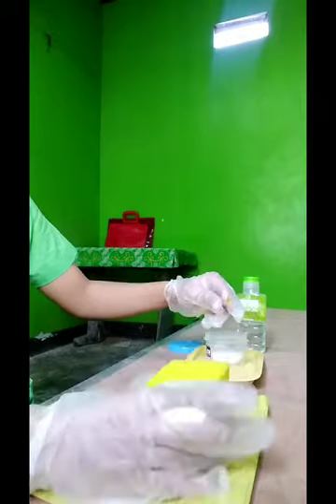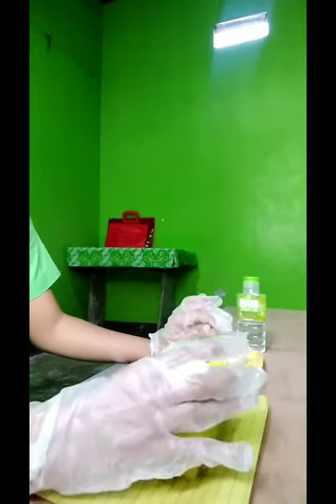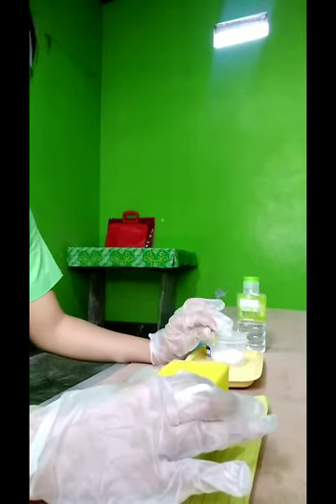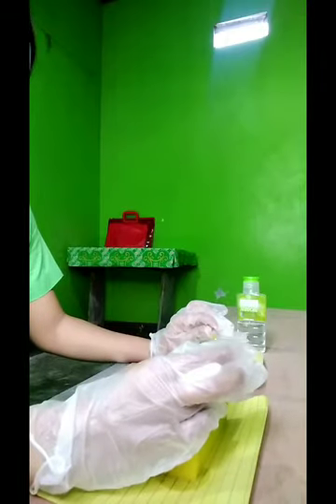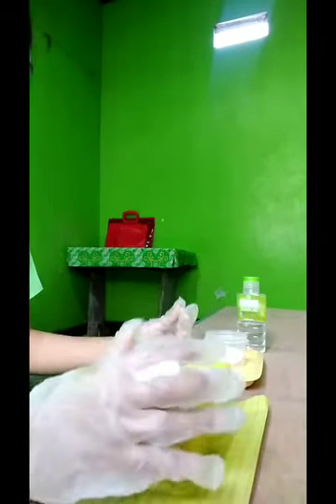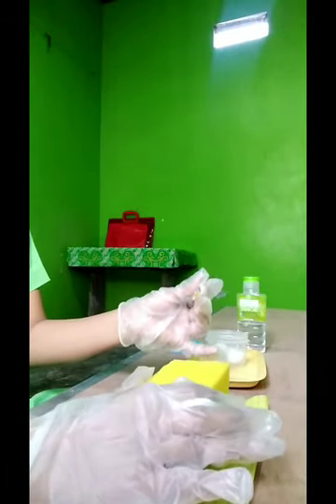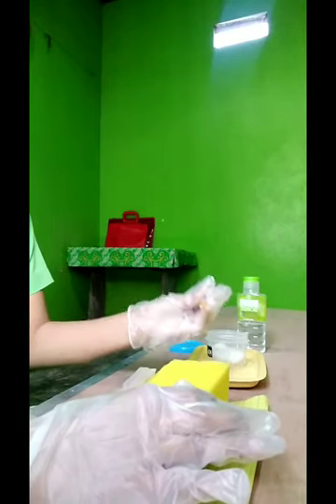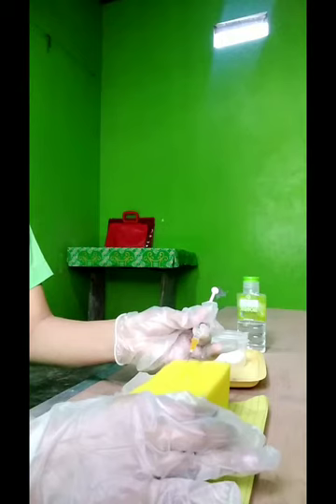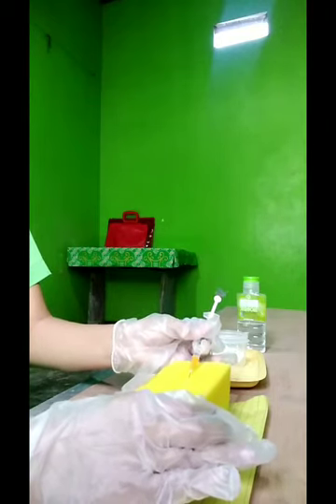Then, grasp and bunch the area surrounding the injection site or spread the skin taut at the site. Hold the syringe in the dominant hand between the thumb and forefinger. Inject the needle quickly at a 45 to 90-degree angle.